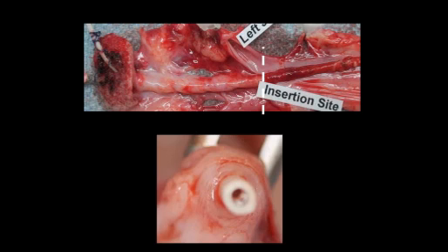This has all kinds of implications. First, as you see in this picture, you see that nice collagenous ring or fibrinous ring around the catheter in the subcu space. But you also see a space in between the catheter and the collagenous ring. It also looks very liquidy. Again, you have some edema, and this will allow for the dispersion of bacteria from the surface of the skin throughout this column. And that column, again, is an open space all the way through the subcu space and the fibrin sheath. It's literally one tube. The other implication here, of a very serious nature, is that when we remove catheters, there is the potential for air embolism through this tube.